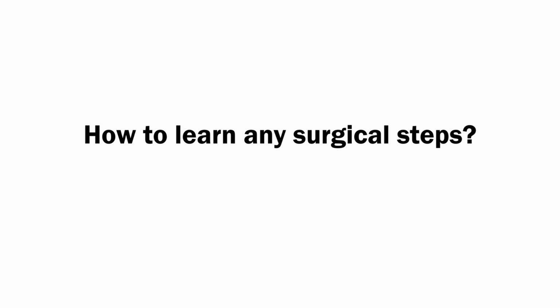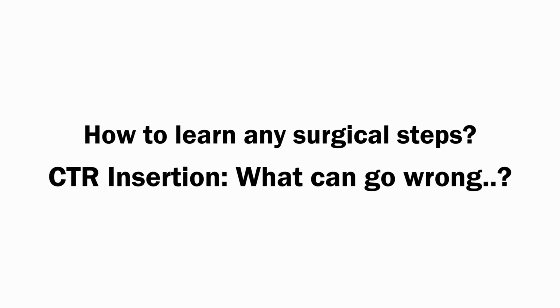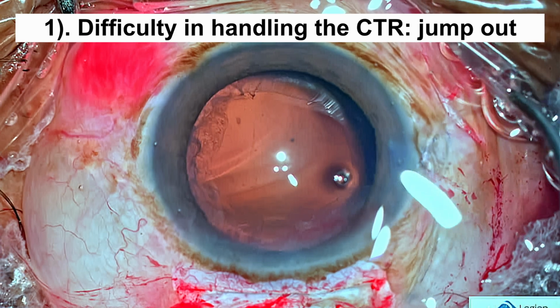An eye surgeon is wanting to learn the technique of CTR insertion. Again, the first thing we need to do is to write down the list of what can go wrong. Number 1. Difficulty in handling the CTR itself.